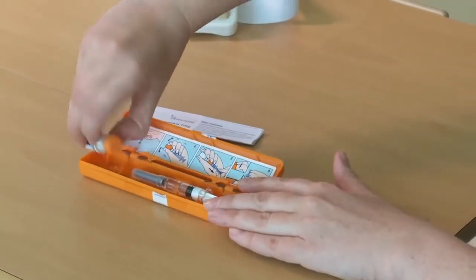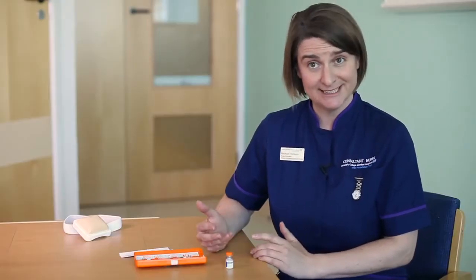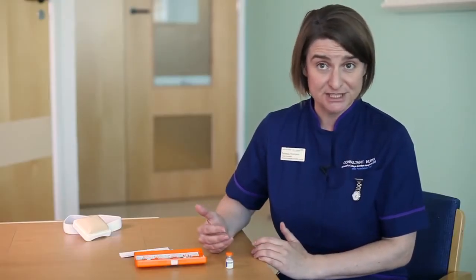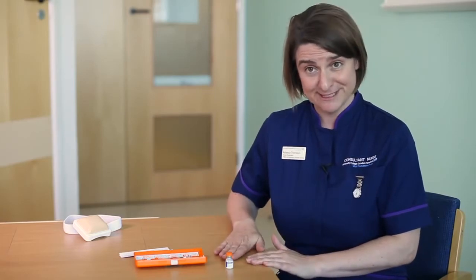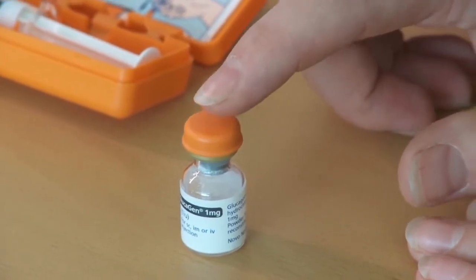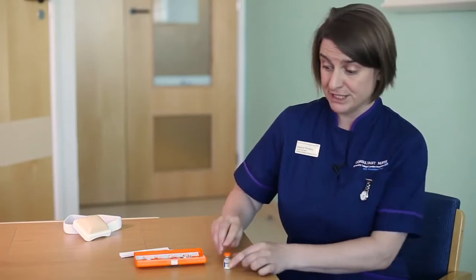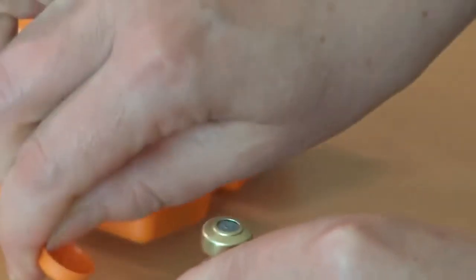I'm going to show you how to draw it up. Taking the vial out of the container and putting it on a table. The chances are your hands might be shaking a little because this is an emergency situation, so if it's on a firm surface it's easier to draw up. There'll be an orange lid on it, which tells you that it hasn't been used before. I'm going to flip off that orange lid. Picking up the syringe — this syringe already has water in it, so it's ready to go — and remove the needle cover.